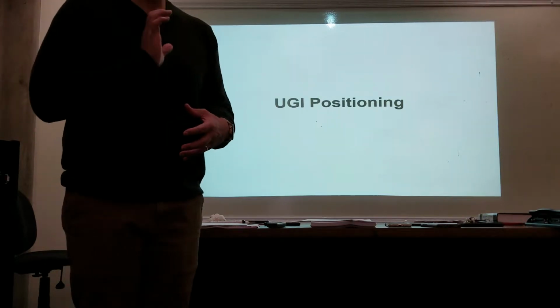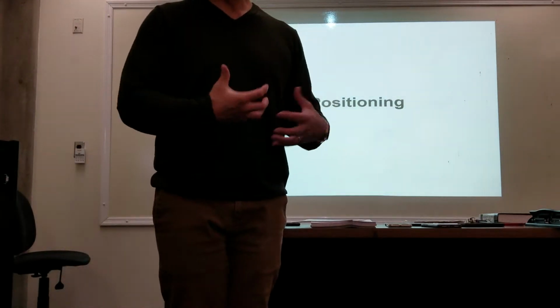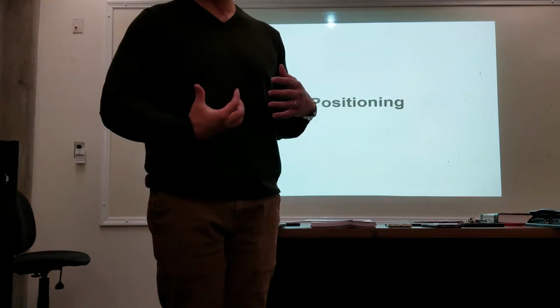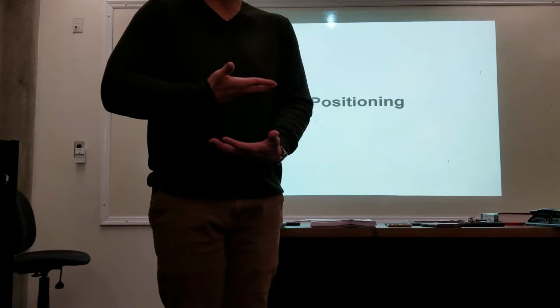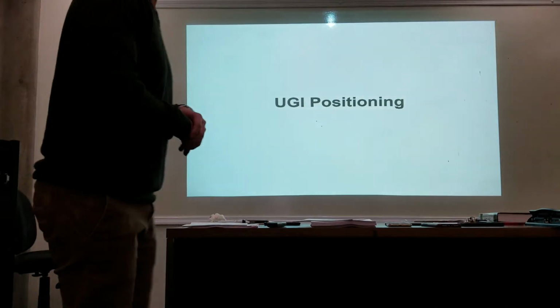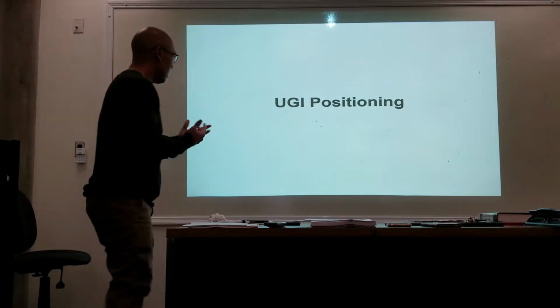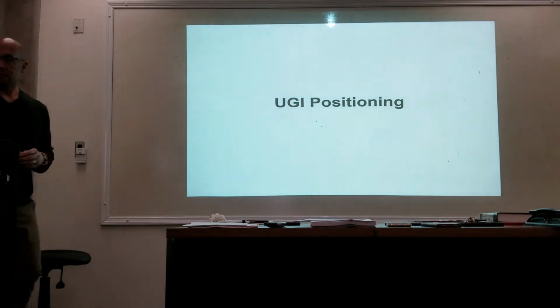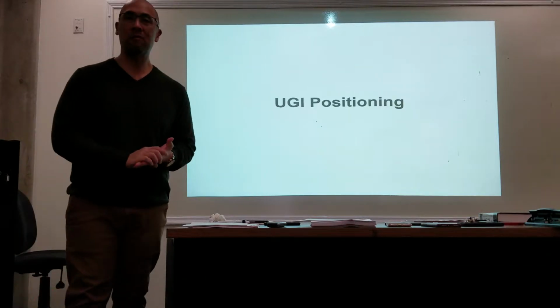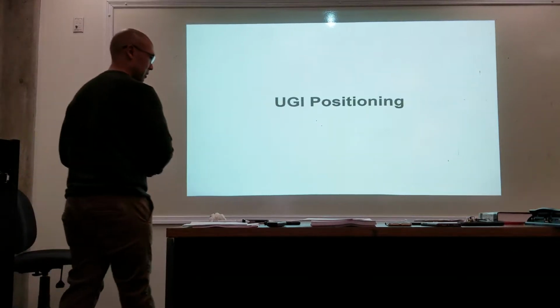So they drink the contrast. Their stomach fills up, they do the examination, and now they wait for the contrast to move around their small bowel, and now we take abdominal images of the small bowel. So there may be multiple procedures that you can do together. For upper GI, the preparation is going to be a little bit more involved.